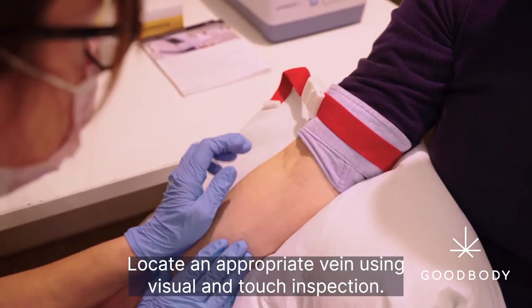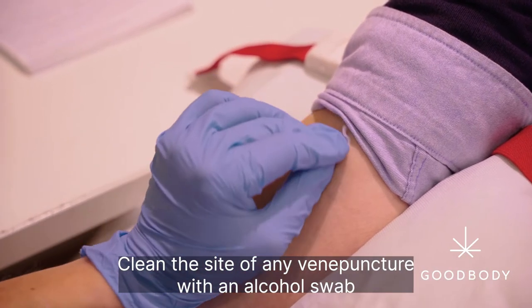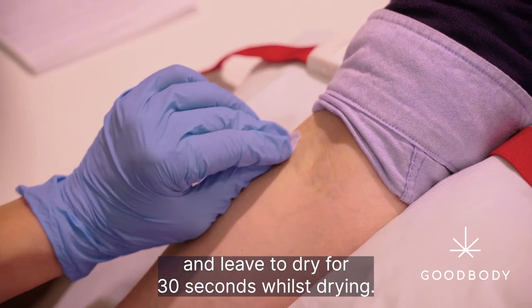Locate an appropriate vein using visual and touch inspection. Clean the site of venipuncture with an alcohol swab and leave to dry for 30 seconds.